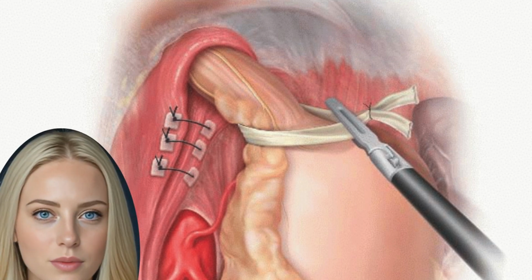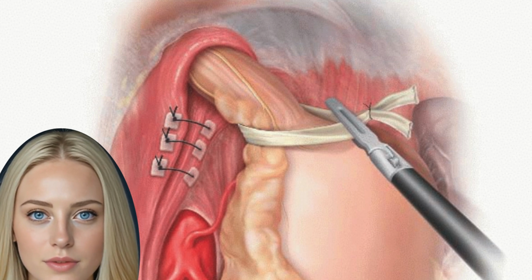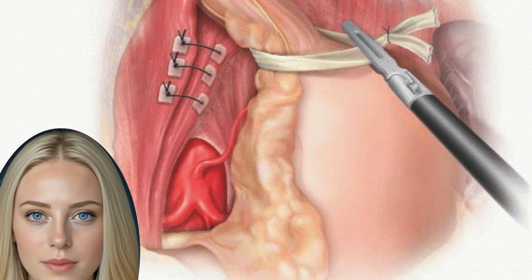Although endoscopic surgical clips may help, it is more efficacious to regrasp the bleeding ligament and vessels for ultrasonic ligation. Fig 10a-c, short gastric vessel ligation. A, B: initial dissection begins at a level parallel to the distal splenic tip. C: completion of the short gastric ligation. Note the exposure of the posterior stomach to complete this step.